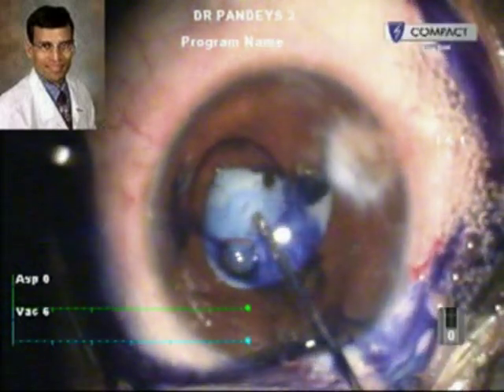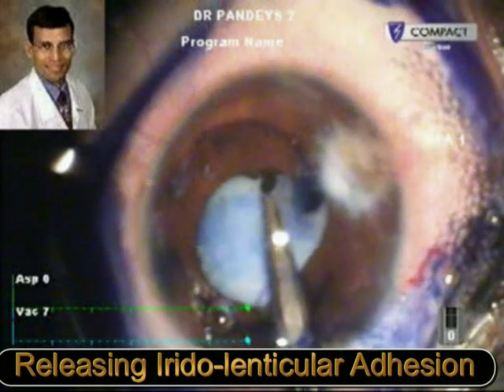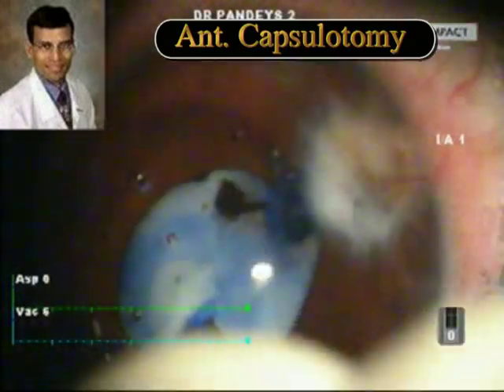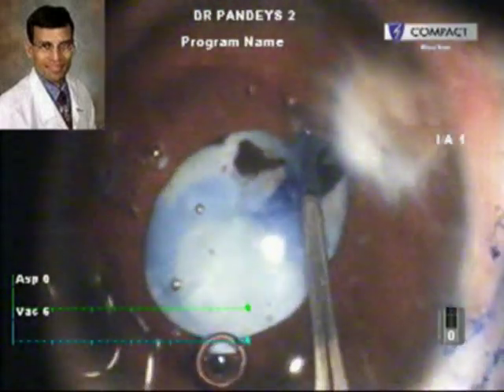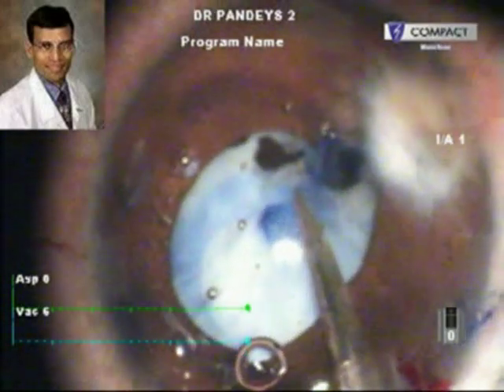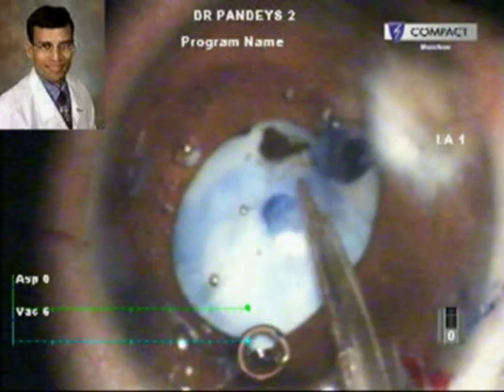The anterior lenticulo-zonular synechiae are removed. Here they are being cut with a Vannas scissor. A capsulorrhexis was initiated in the area away from the synechiae and the area of fibrosis. However, in the fibrotic area, the rhexis could not be completed because the capsule was very fibrotic and therefore it was cut using a Vannas scissor.